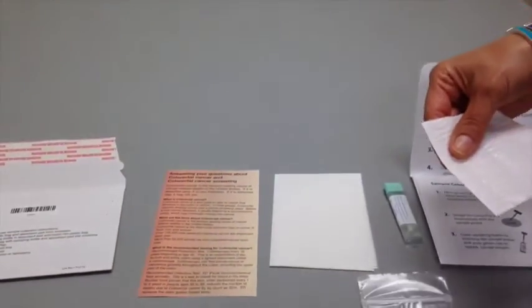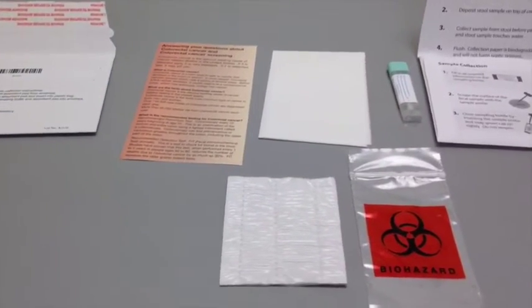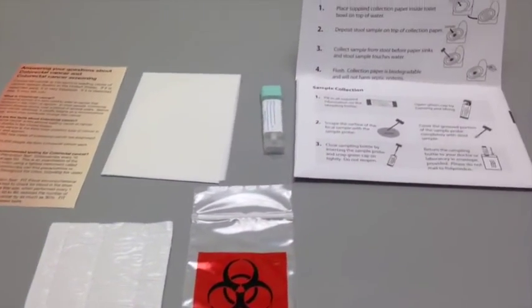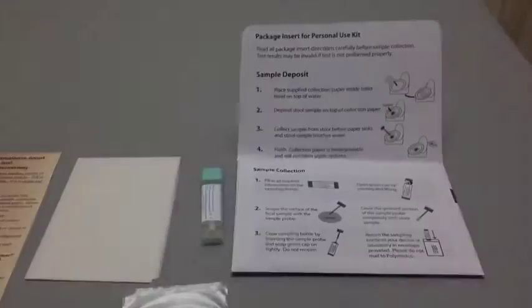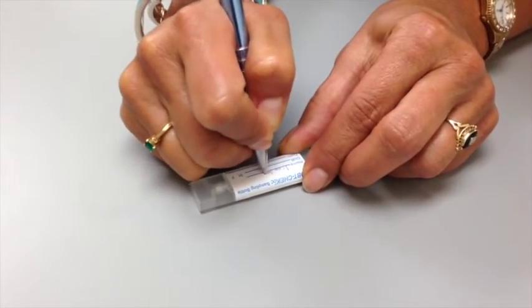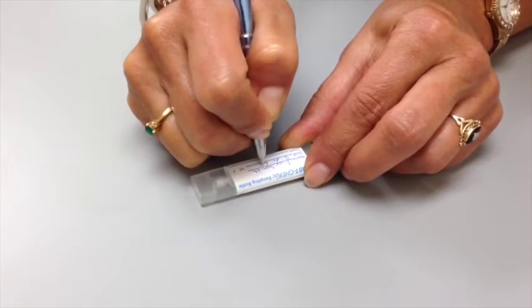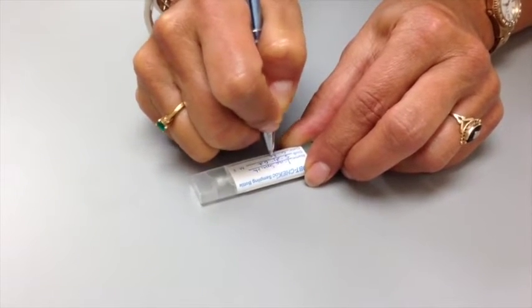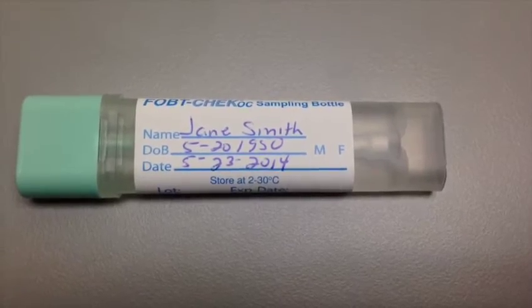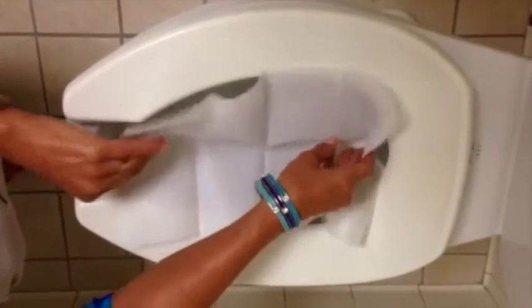Read all package insert directions carefully before sample collection. Test results may be invalid if the test is not performed properly. Fill in all required information on the sampling bottle with a ballpoint pen. Place the supplied collection paper inside of the toilet bowl on top of the water.